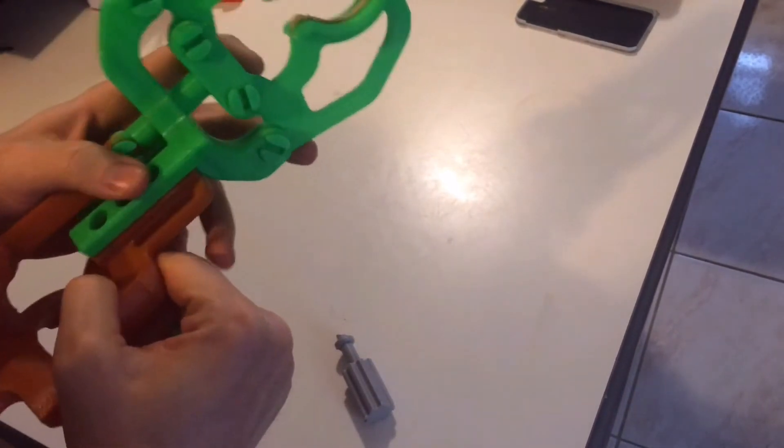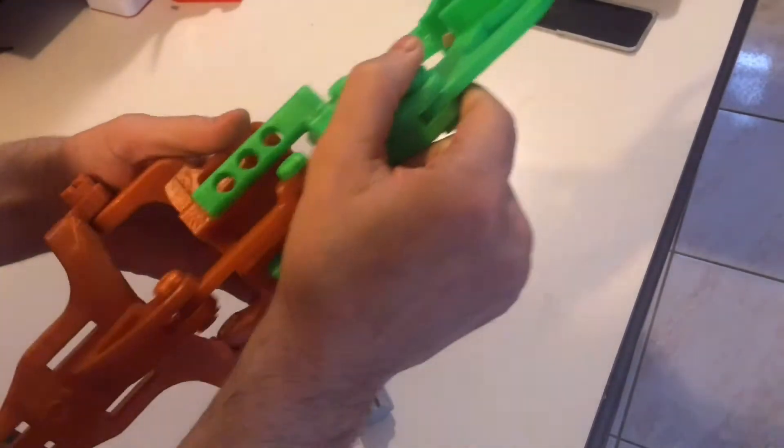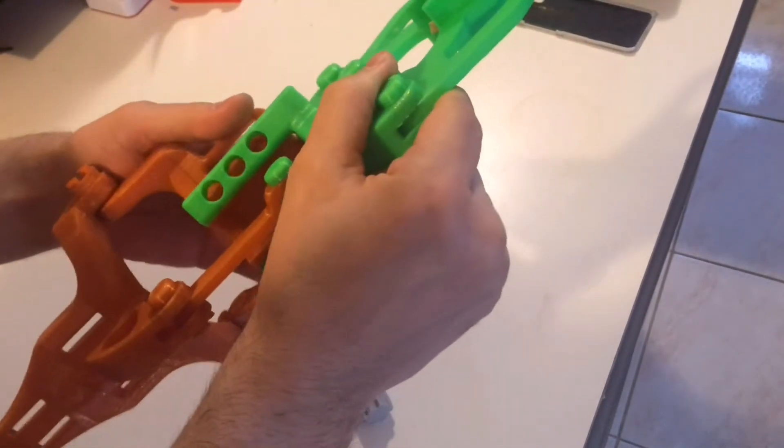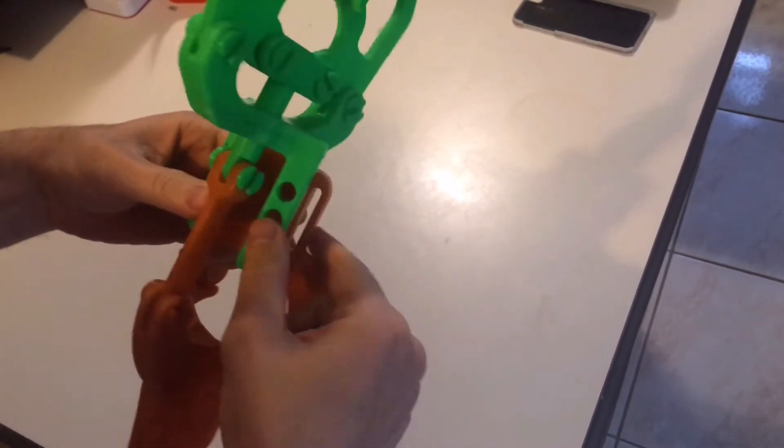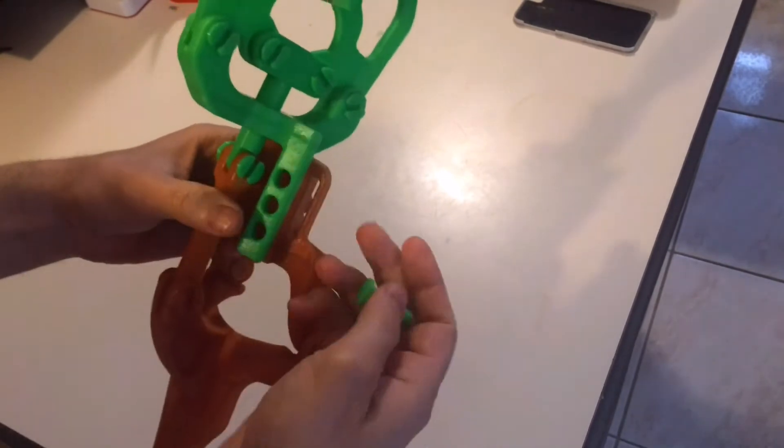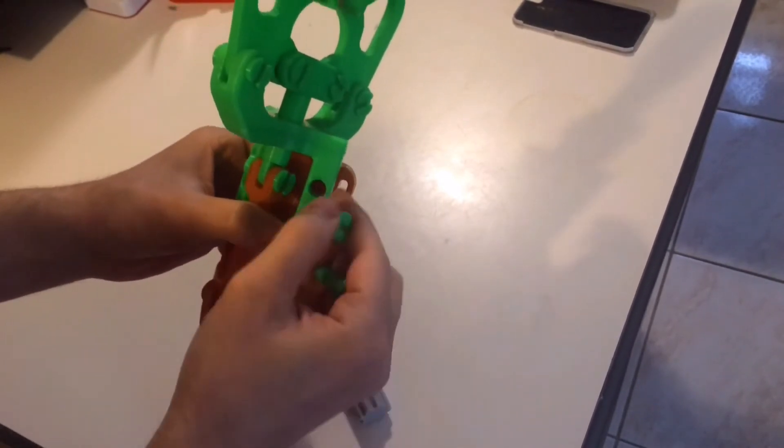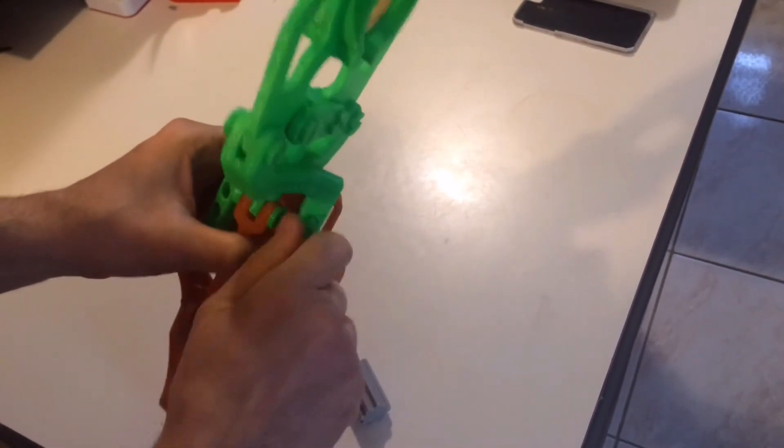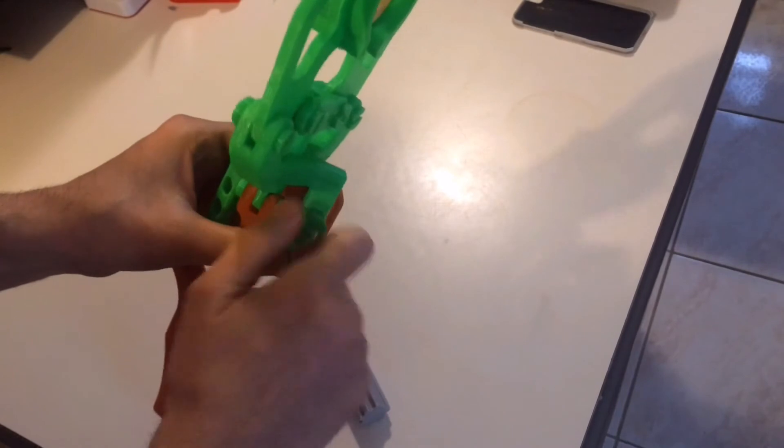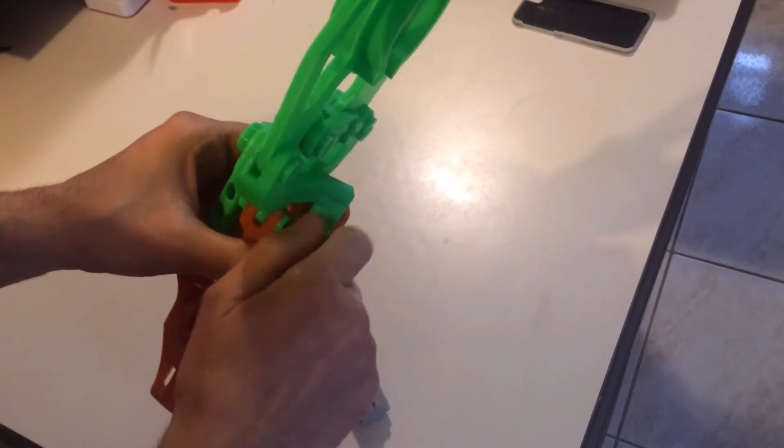So what you do is you lay that flat, you decide the length and what you want. So for now, I'm just going to go the first hole. So you just push it in, you turn it on.